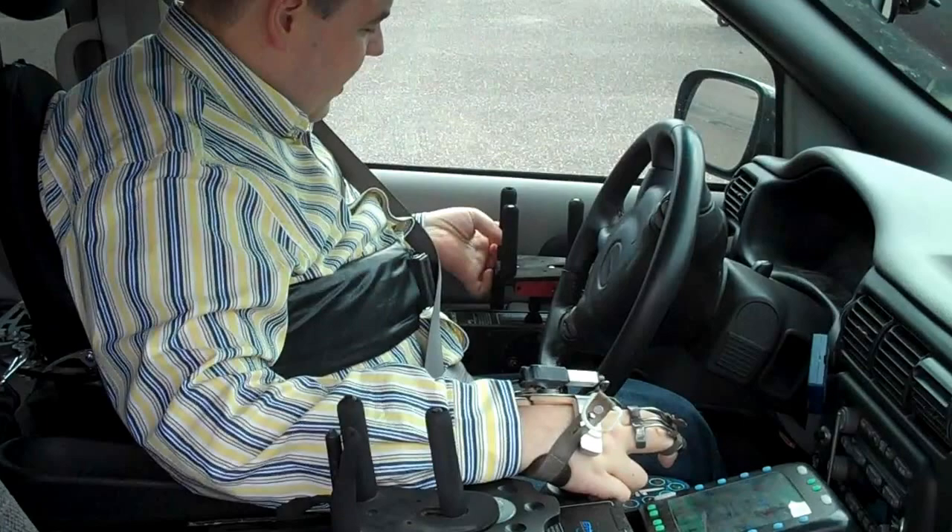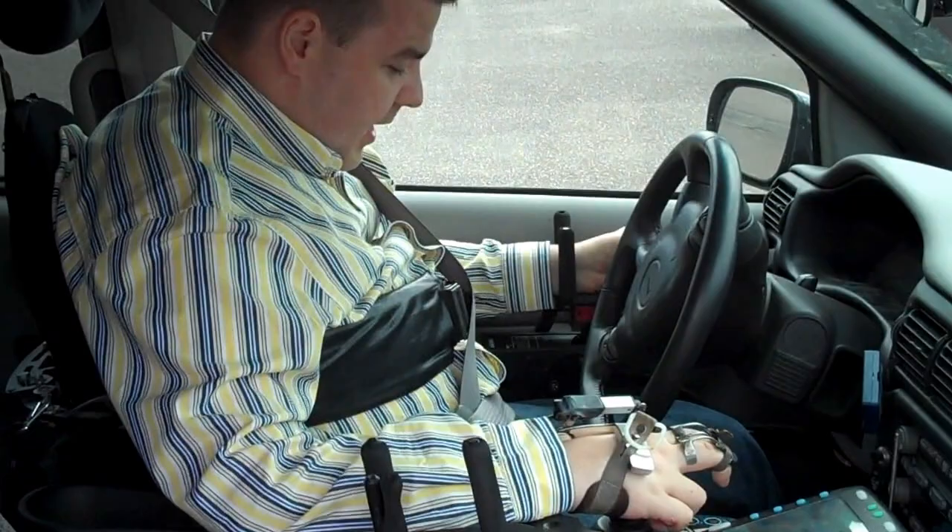Then I'm locked in, and here I have the gas and brake control, so I pull back for gas and I push forward for brake.